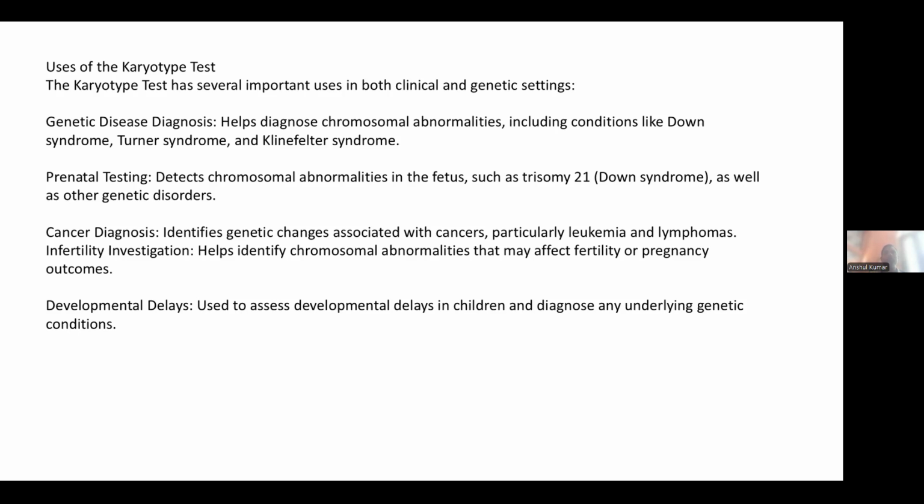So it becomes easier for us to detect abnormalities at the structural level, which either overexpress some genes or suppress them at the chromosomal level. So it is a very important tool in modern-day medical sciences, and it is quite useful for diagnosis of some important syndromes or disorders which are very difficult to diagnose at the cellular level.